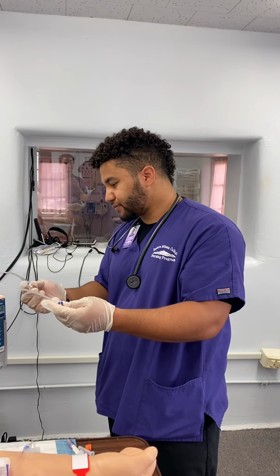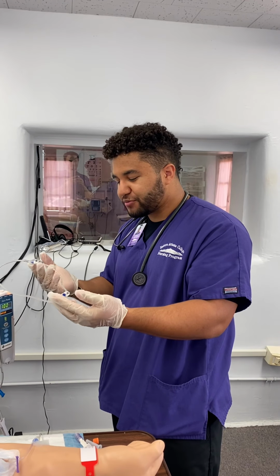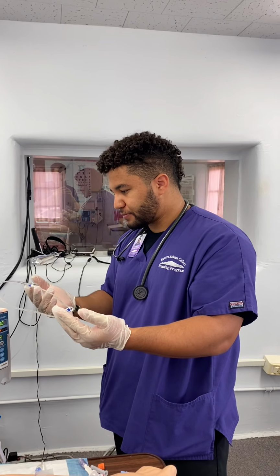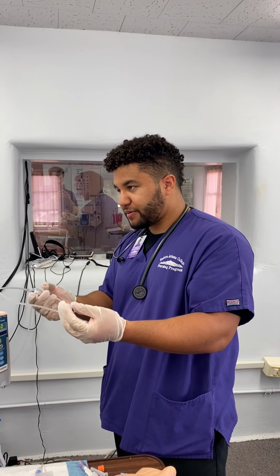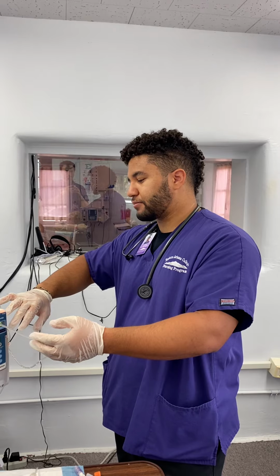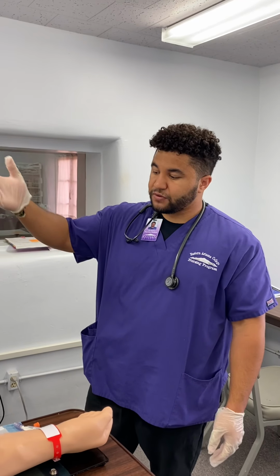All right, so ideally you would have new tubing and you wouldn't have to reuse it. But you want to make sure that this is completely primed, that there's no bubbles in it. If this did continue to happen, you could just always restart, grab new tubing, grab new medication, and make sure that it's infusing properly, that there's no air in the line.